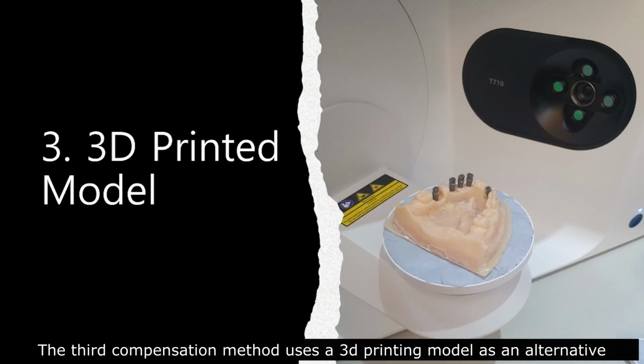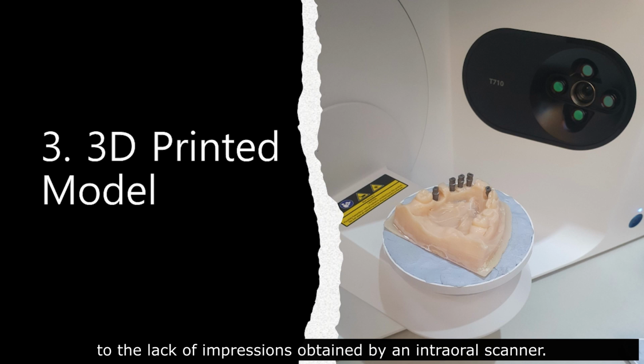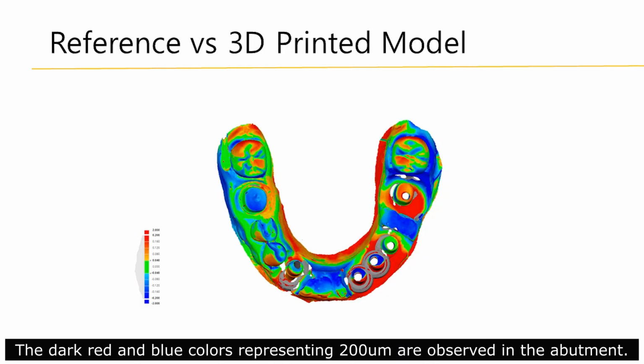The third compensation method uses a 3D printing model as an alternative to the lack of impression obtained by an intraoral scanner. The dark red and blue colors representing over 200 micrometers are observed in the abutment.